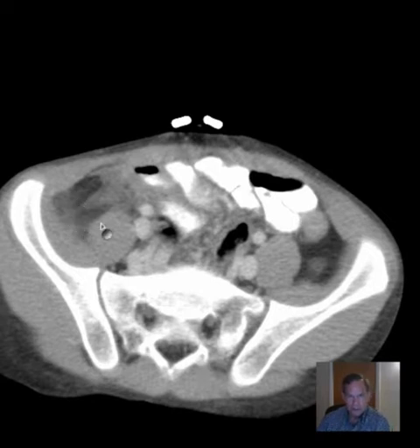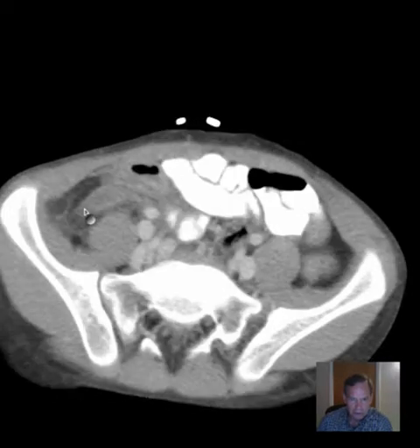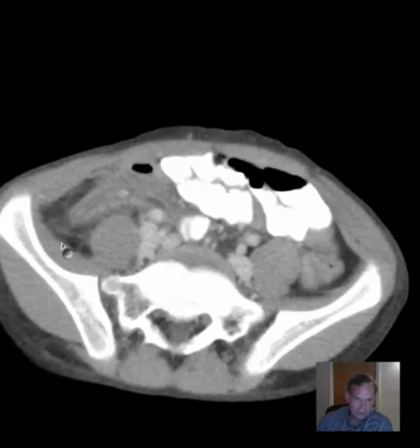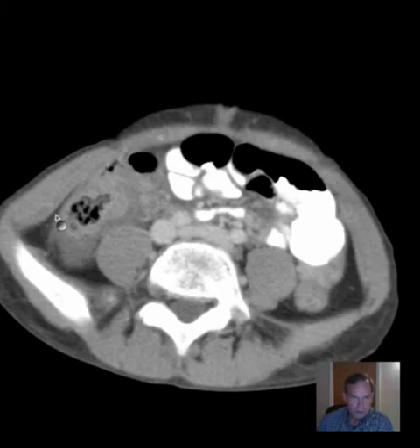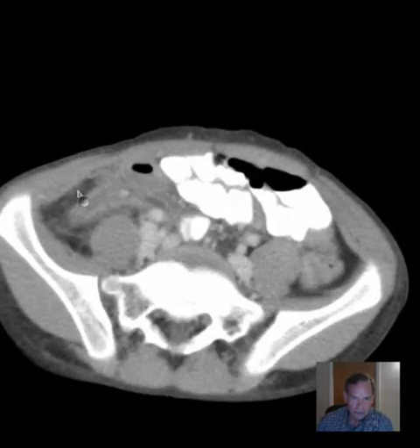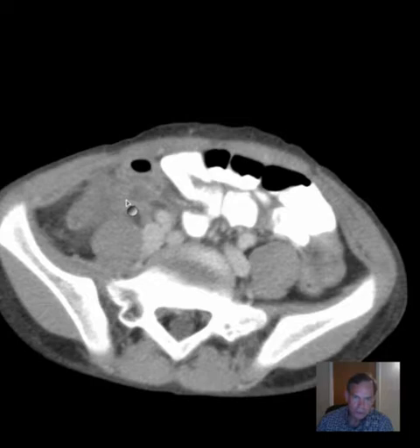This is a good image showing you the nice, clean fat here in the retroperitoneum and in the peritoneum. And here we have stranding that's really quite conspicuous. So what could be causing it? We have a structure here that's tubular and it has a little high attenuation focus in it, so that looks suspicious for an abnormal appendix.